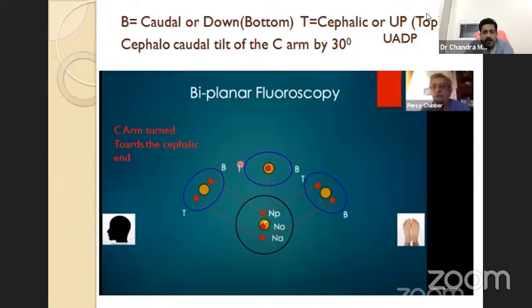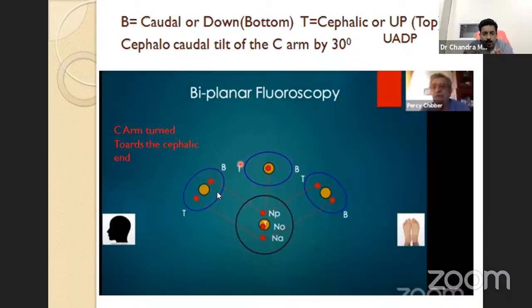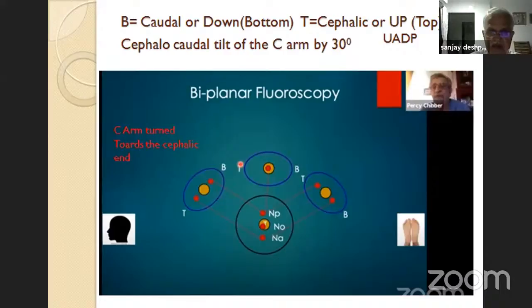What you said in the beginning is whenever you puncture at 0 degree, you don't know the depth. At 30 degree, you will know the depth. For 30 degree, you can rotate the C-arm towards you, away from you, towards the head end, towards the down end. There are four options available. In these four options, there are only two things you have to remember. When the C-arm is turned towards you, the lateral part will appear anterior, or anterior appears lateral, whichever is correct. So if the needle is more lateral towards the spine, it is anterior. That means you have gone deep. That is called LAMP: lateral, anterior, medial, posterior. That is clearly posterior. Understood.